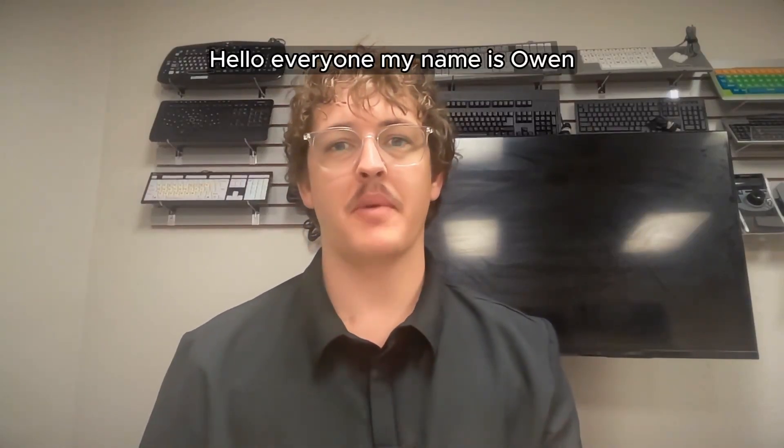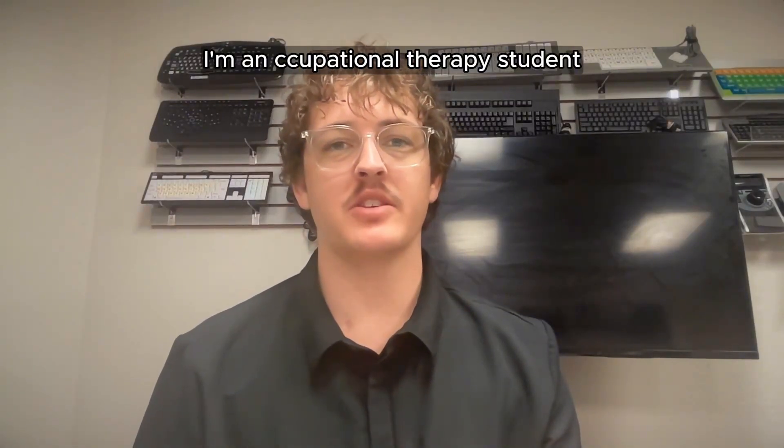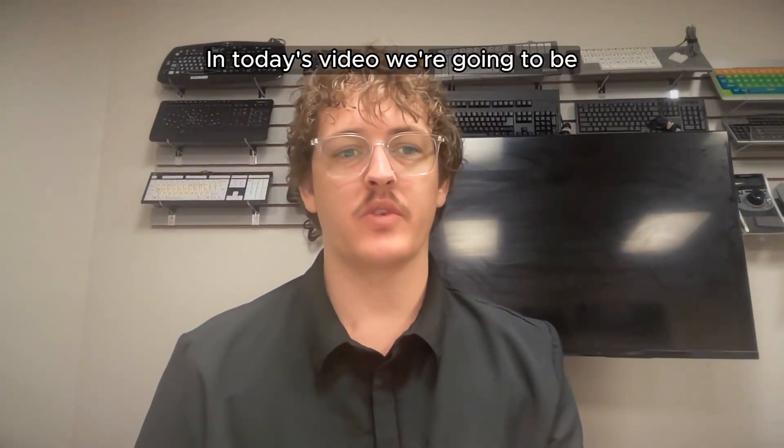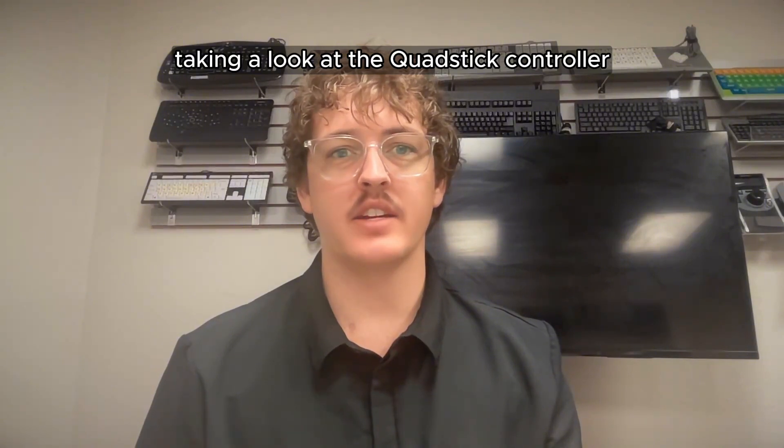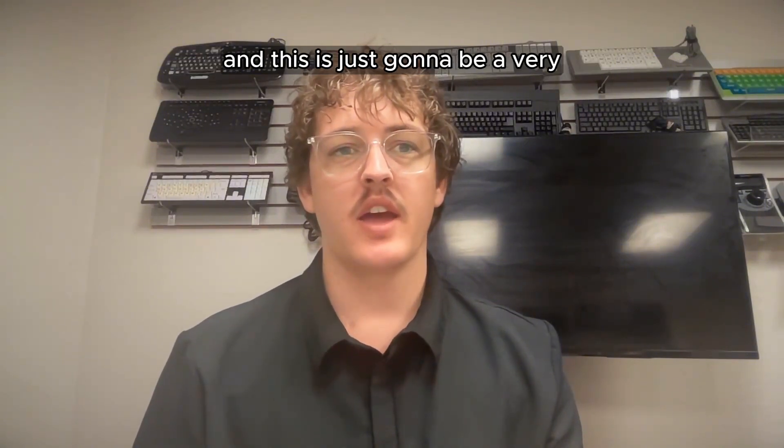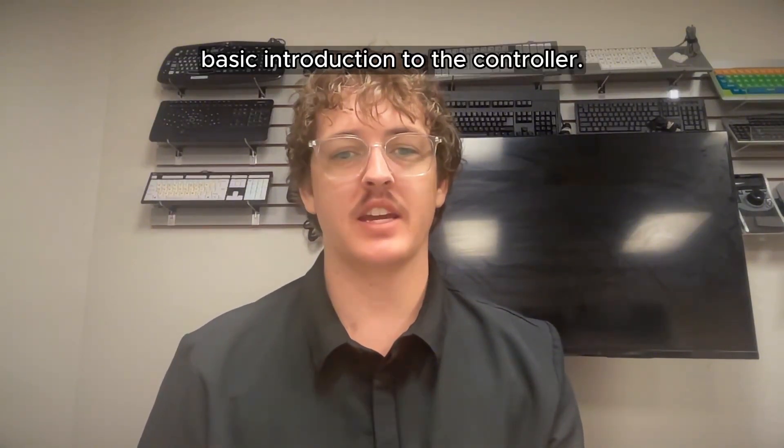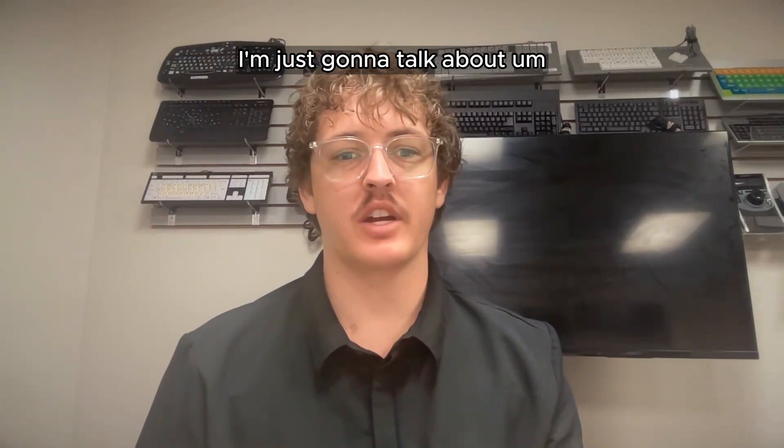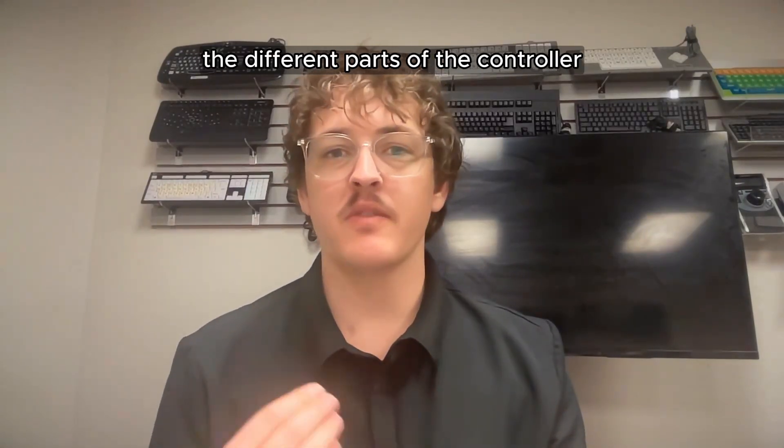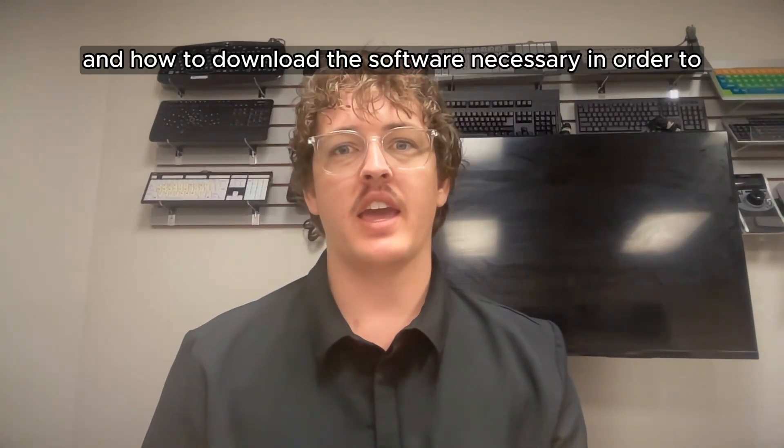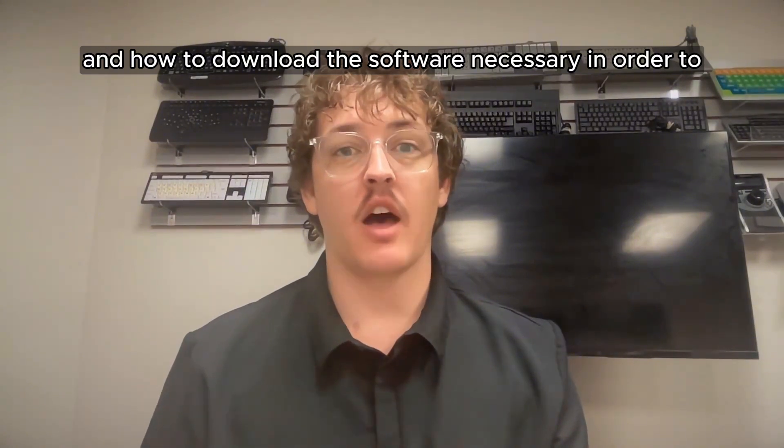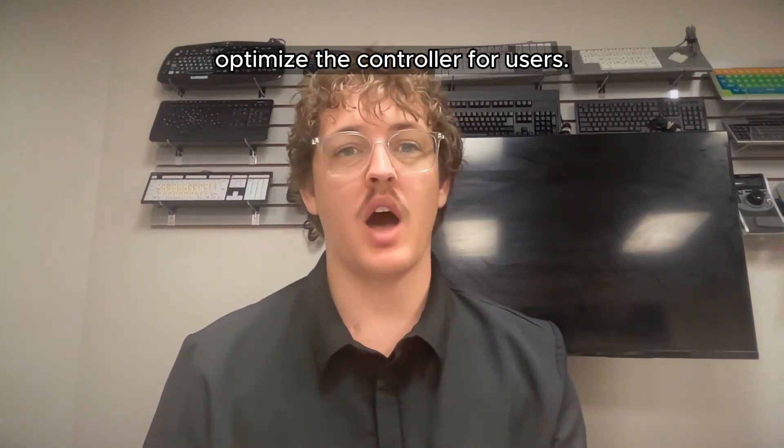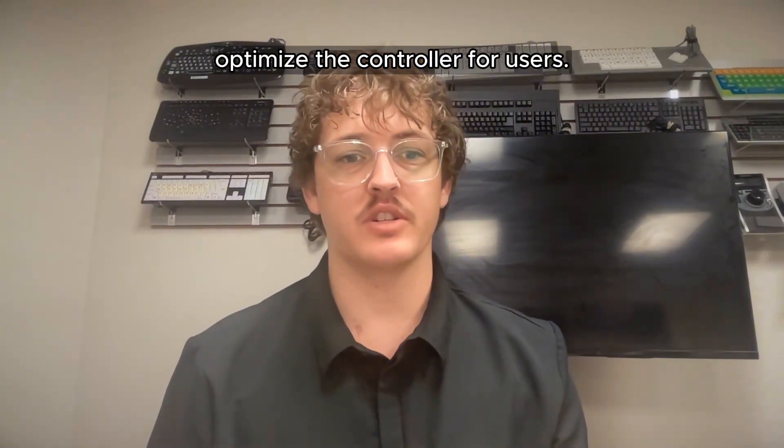Hello everyone, my name is Owen. I'm an occupational therapy student working with the Arizona Technology Access Program. In today's video, we're going to be taking a look at the QuadStick controller. This is just going to be a very basic introduction to the controller. I'm going to talk about the different parts of the controller and how to download the software necessary in order to optimize the controller for users.